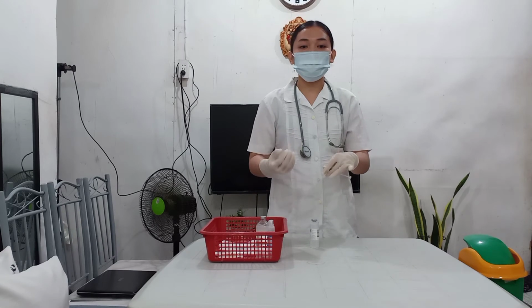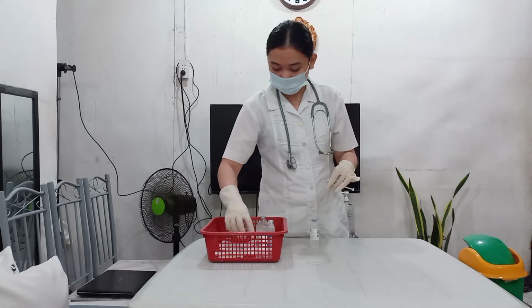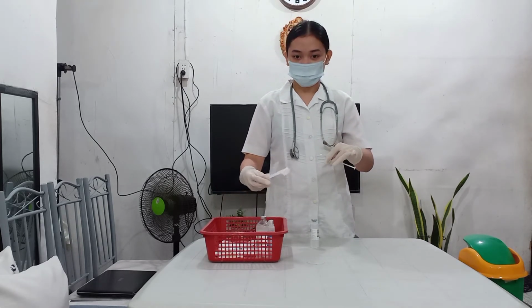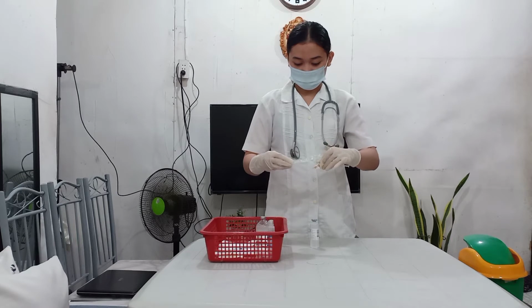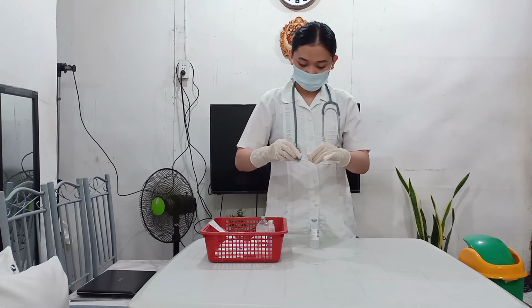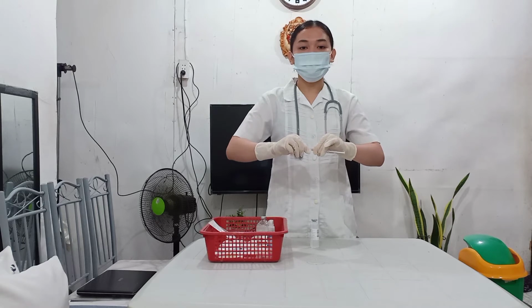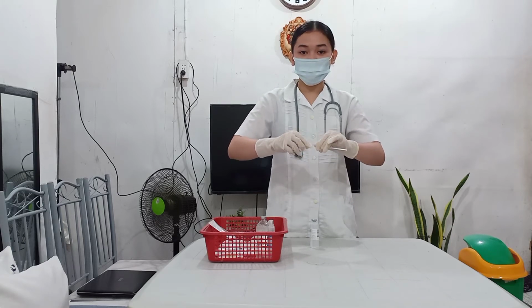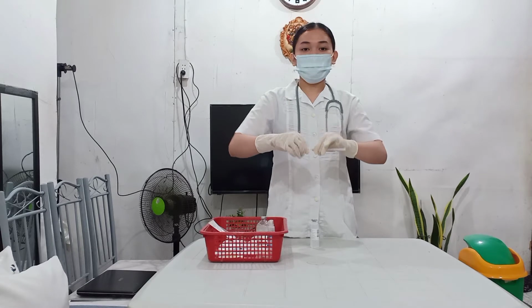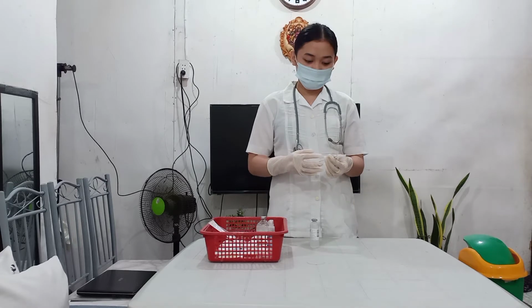Next is to replace the filter needle using the original needle of the syringe. We tighten the cap at the hub of the needle and then we push solution into the needle to the prescribed amount. This is to remove residue from the needle. Change needles after preparation and before administration.